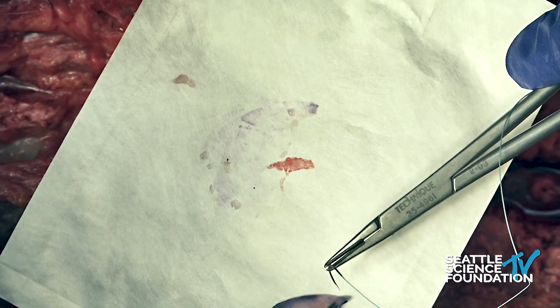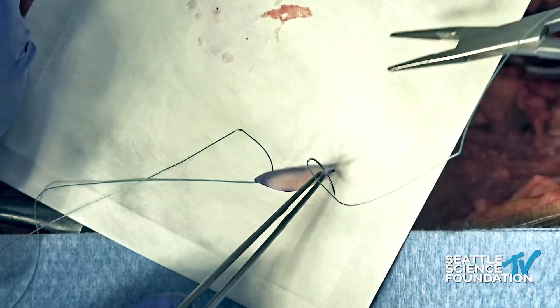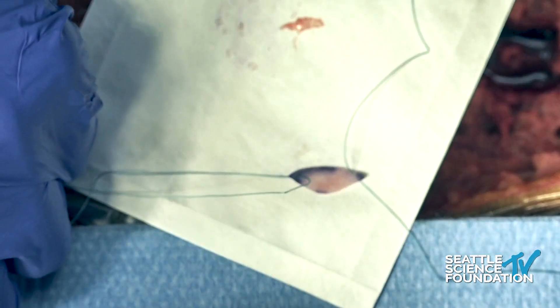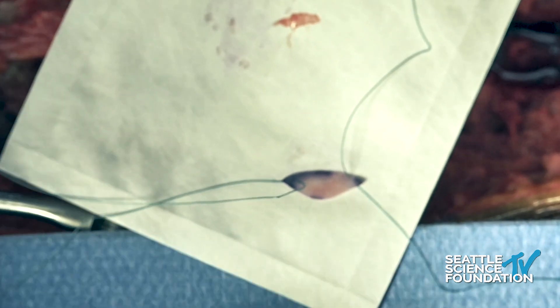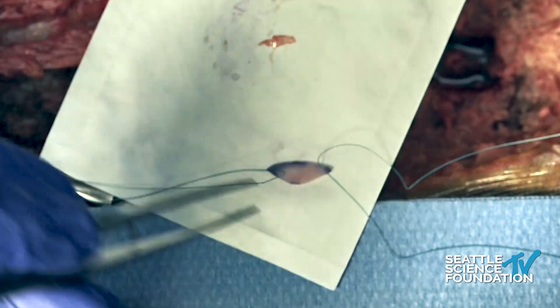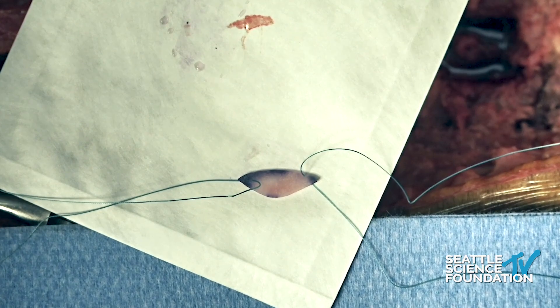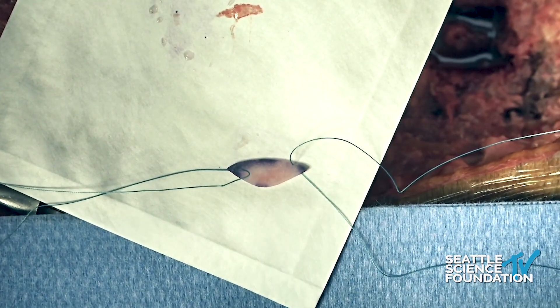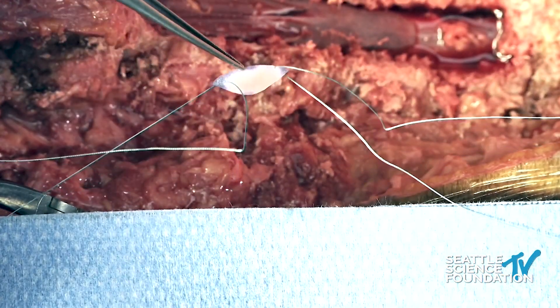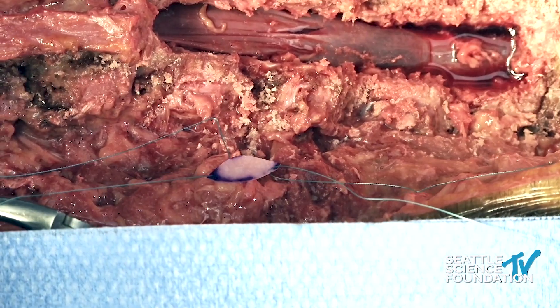Just to hold it in place. You gave an amazing talk on dural pathologies that really opened eyes, so we appreciate your expertise. Thank you, totally my pleasure. We need to focus in a little bit more — we can't see the dural patch, it's kind of out of focus. Perfect. So what we've done is we've placed those sutures through the apex and now we will suture those to secure it in place. You can see we hold the suture with a snap to the drape.